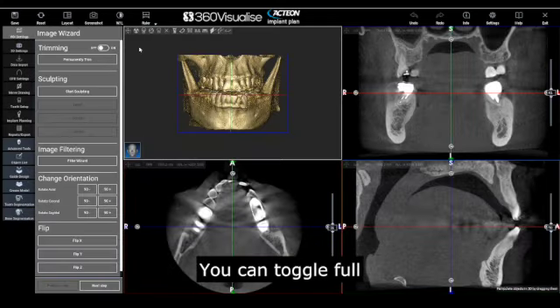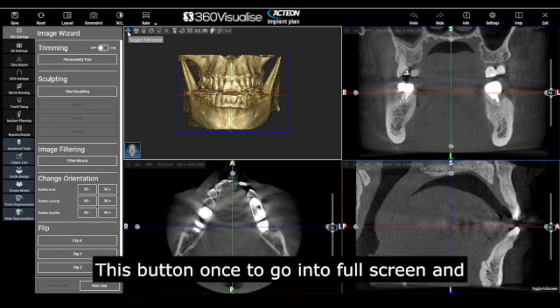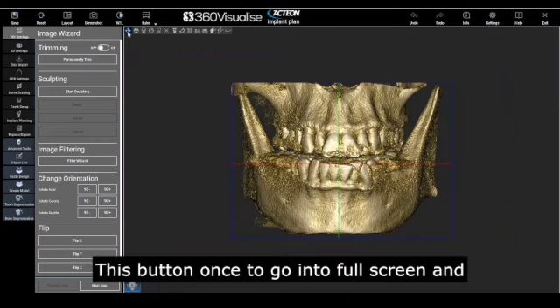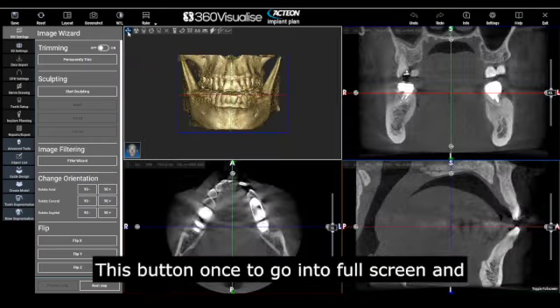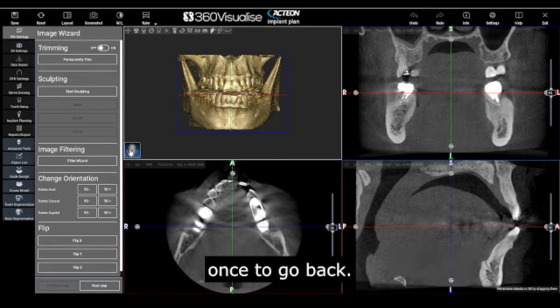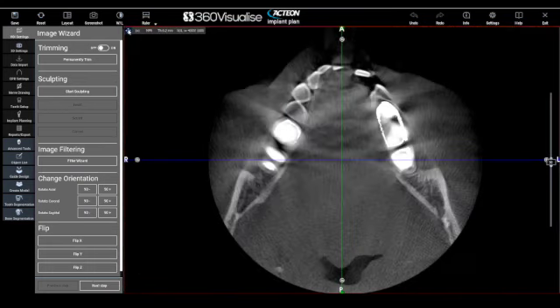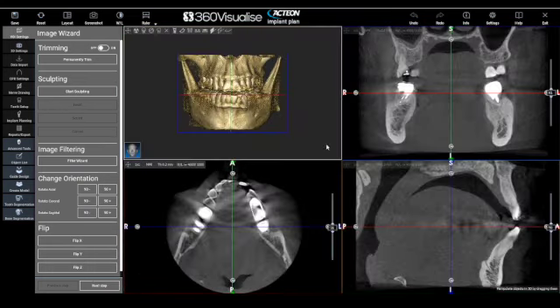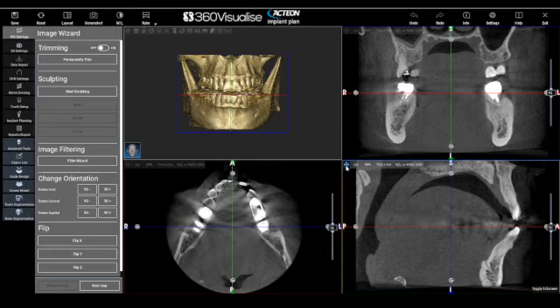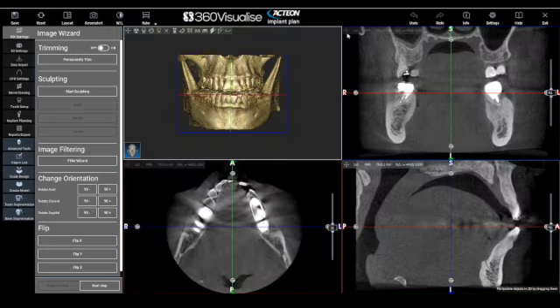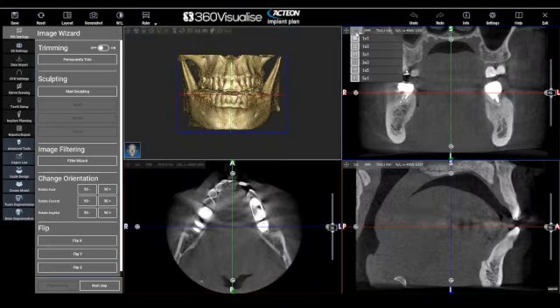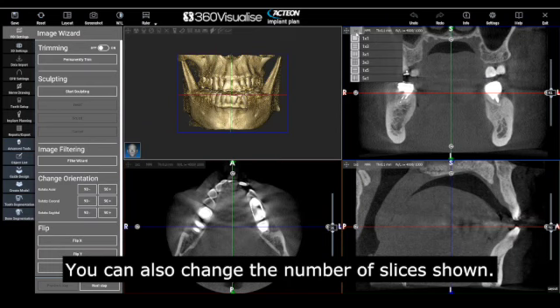You can toggle full screen by clicking this button to go into full screen and back. You can also change the number of slices shown.